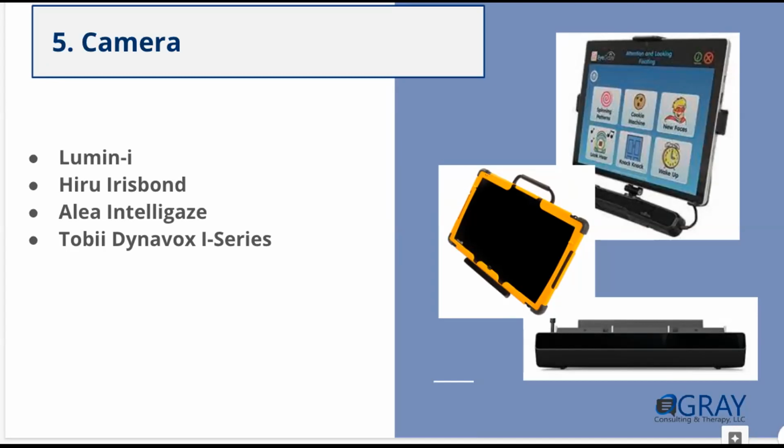But after doing, I was trying to think of it coming into this, like I'm pretty sure I'm around 400. I've participated in about 400 eye gaze evaluations that I still cannot walk through a door and recognize who will be a good eye gaze user and not be a good eye gaze user. You've got to offer the opportunity and let it happen, and it's either going to work or it's not going to work, and like, gotta try.